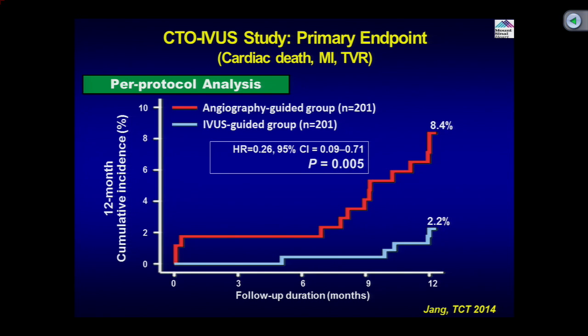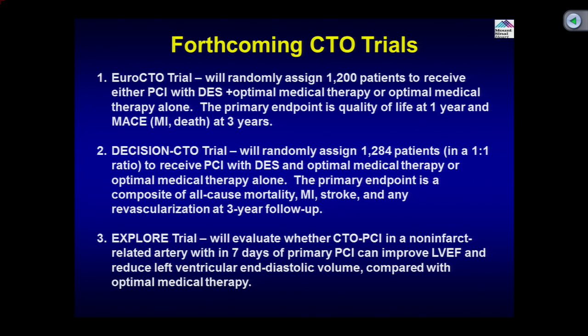So really, it seems to be that once your wire has been distally recanalized, that IVUS does help in a randomized fashion. We have presented in this setup many other randomized trials of the DES with the IVUS guidance. So far, there has been no clear benefit. One registry data of the left main from Park did show that IVUS guidance have a better, lower mortality compared to angiographic guidance in the left main case, but this will be the first study of its kind showing positive result of the per protocol IVUS guided versus angiographic guided.